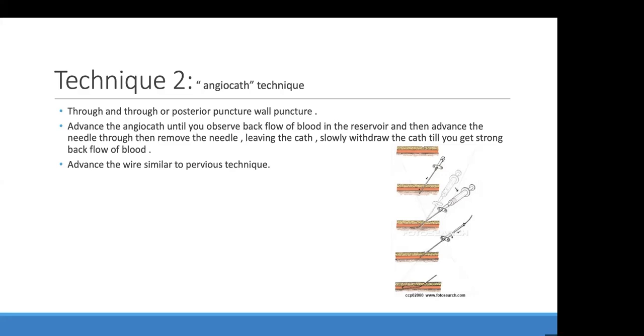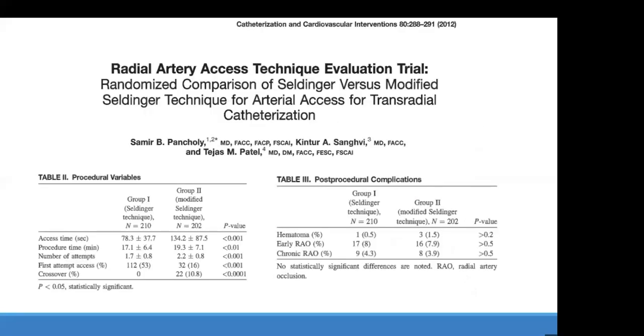Actually they did a study comparing both. Both were efficacious and both are good. I used it initially in my training, but then I got so comfortable with the Seldinger technique that I used it as my default. You can use this or that technique based on your comfort and your training level. Again, I don't like it because it's extra equipment that you add, and there is that theoretical risk that you are puncturing the posterior wall, but it doesn't matter. Even if you transfix, it will seal with the sheath as it is introduced.